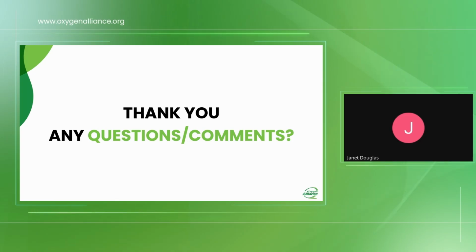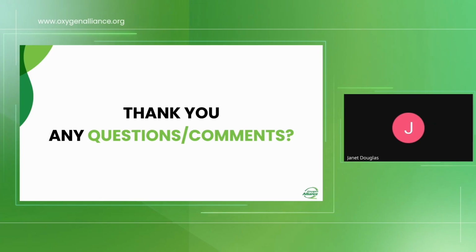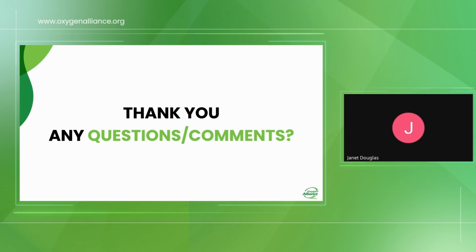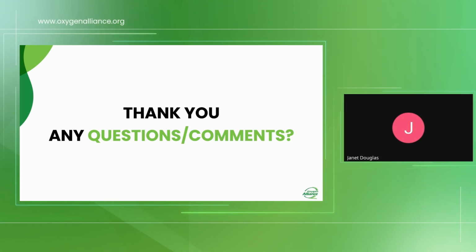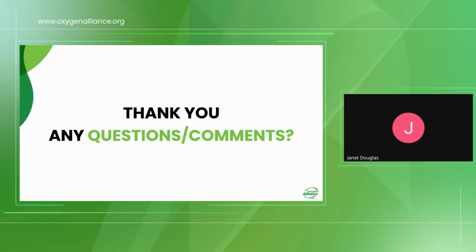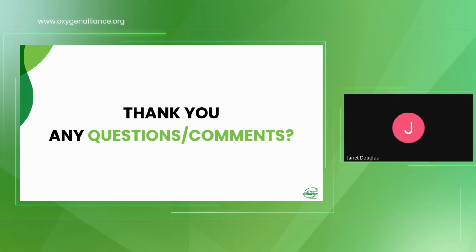Yes, thank you, Kelvin. I just wanted to add that I think the question was also talking about the NIBP machines. These are the small ones, not the whole patient monitor. If you're using these ones, there are a few buttons over there, and normally you see an M or S button. M is for memory. When you long press either of these buttons, based on the device that you're using, it takes you to the memory of the device, and then you can navigate through the navigation keys to what you need to erase. Then you press OK, and then you delete. Thank you.